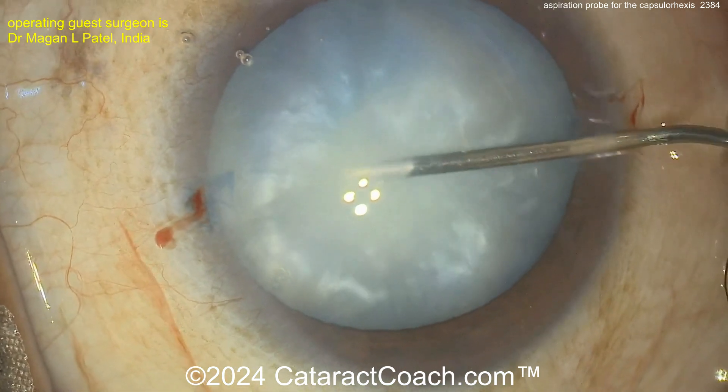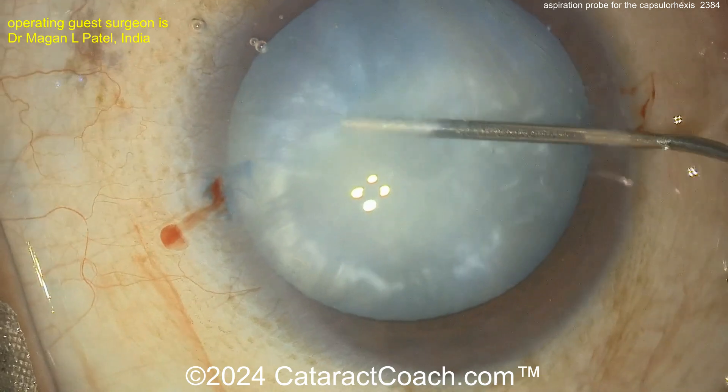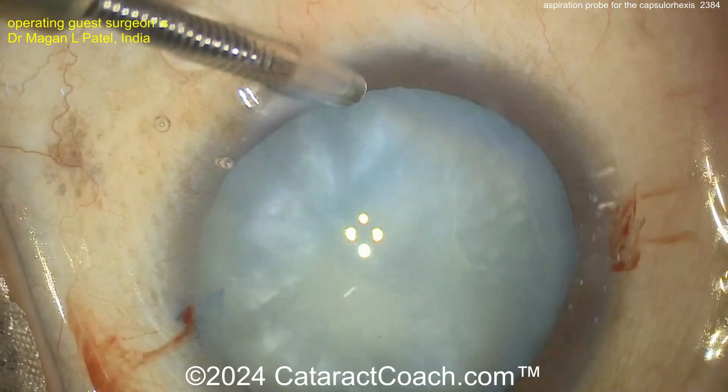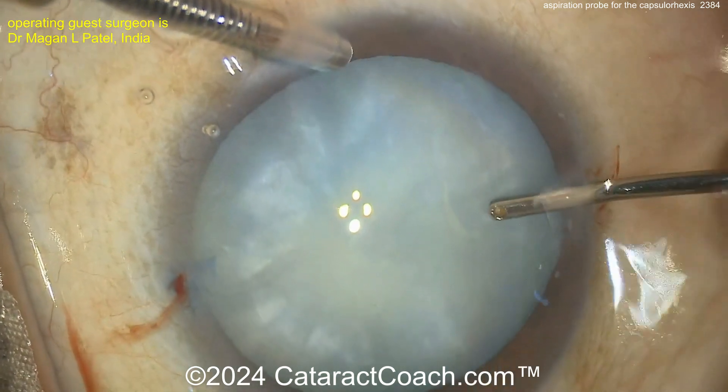Remember, rock the nucleus — get the fluid that's behind the nucleus as well. Good decompression. And once it's decompressed, this surgeon prefers to use, check this out, an aspirator.